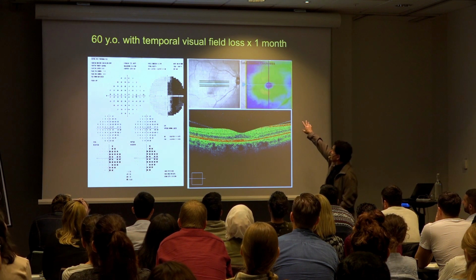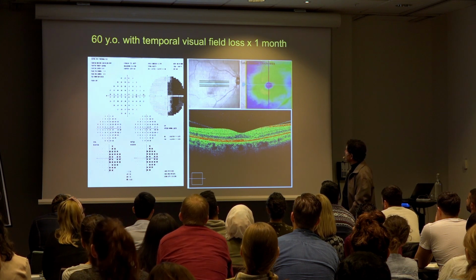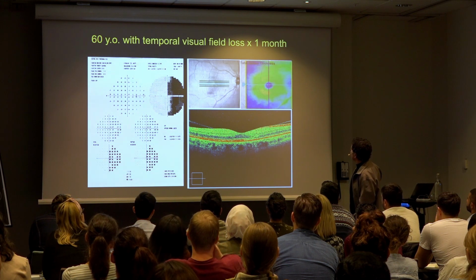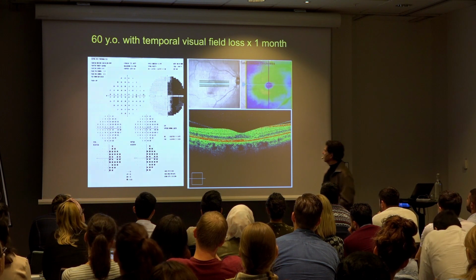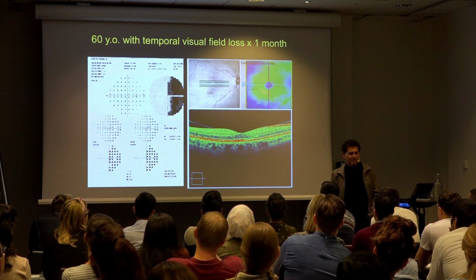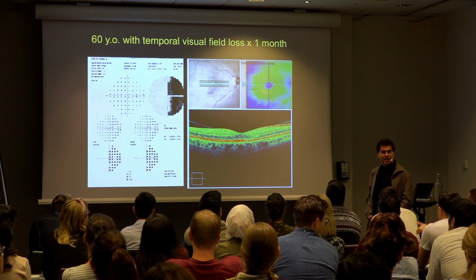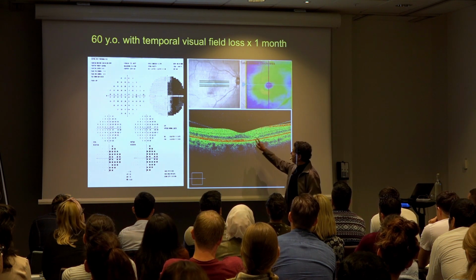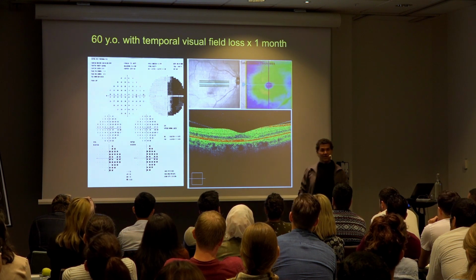Well, that's total retinal thickness there. So this is the right eye now. And if you look at that thickness plot, it doesn't look like much of a pattern, but how about the B scan? What do you see there? I see, which eye was this? Right eye. On the nasal side of the fovea, there is an atrophy. Where? Here, you mean? Yes. What is that line? Ellipsoid zone.